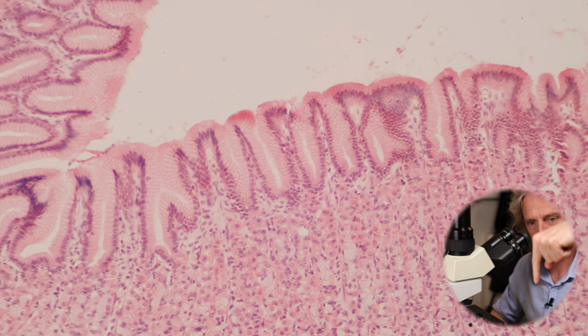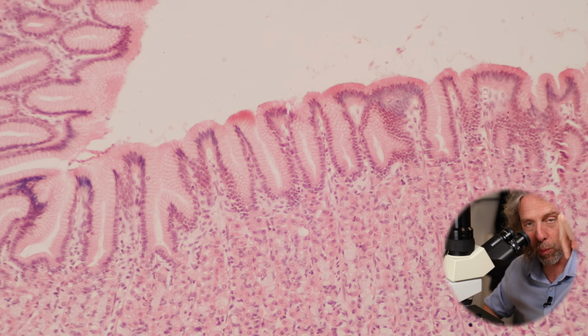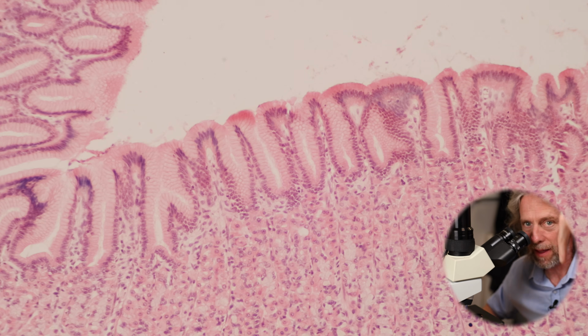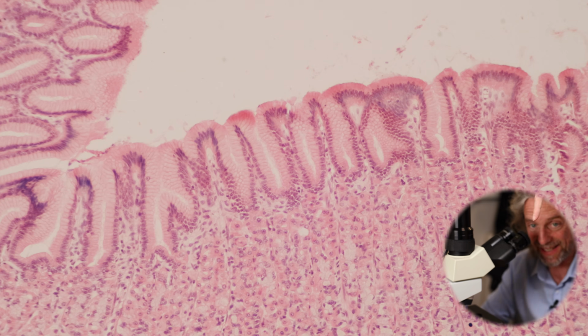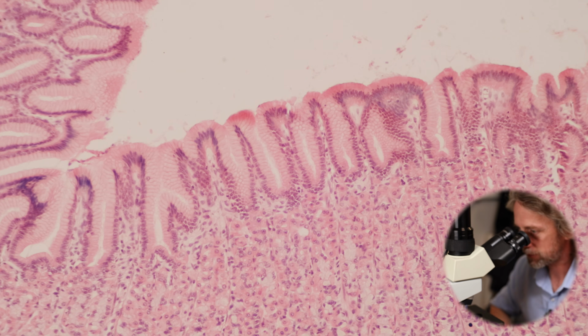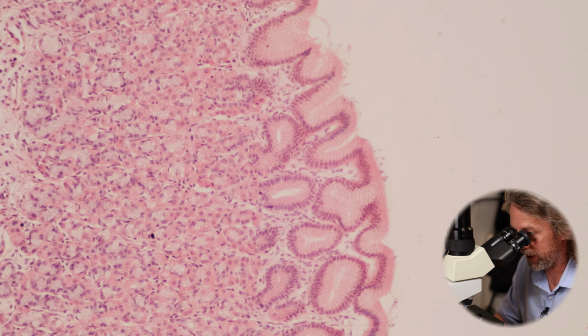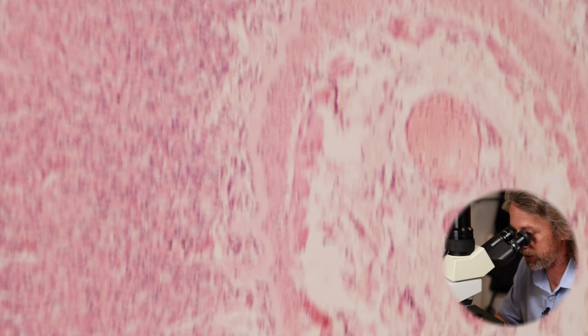But of course that tubular pit that's going into the mucosa, it might be a bit wiggly, might be at a bit of a funky angle, and because we're cutting thin sections through the tissue here, these sections are probably about 10 microns, 10 micrometers thick, depending upon whether we've cut on the same axis as that pit, as to whether we see the pit like that or whether we see these sorts of shapes over here. Can you imagine that we've got glancing blows to those gastric pits, which is why they look different here.